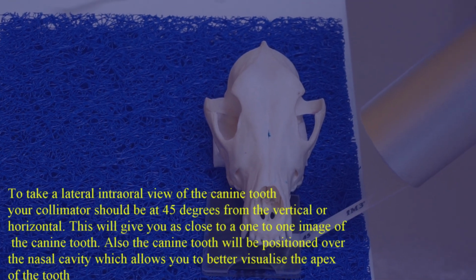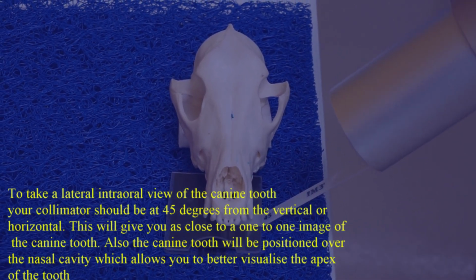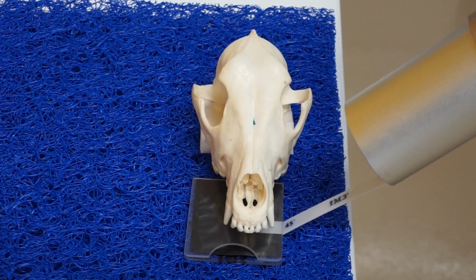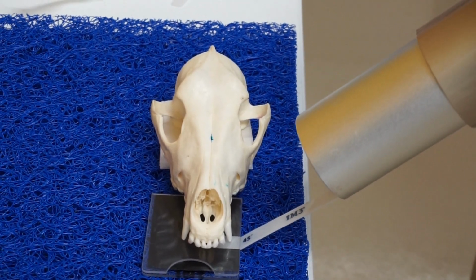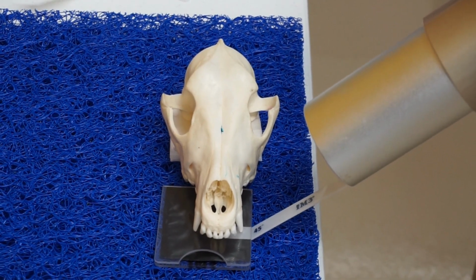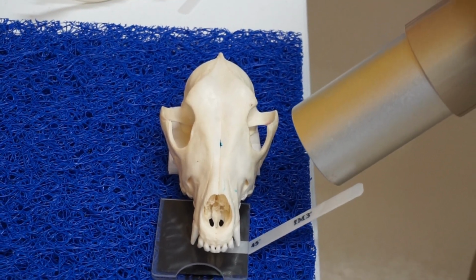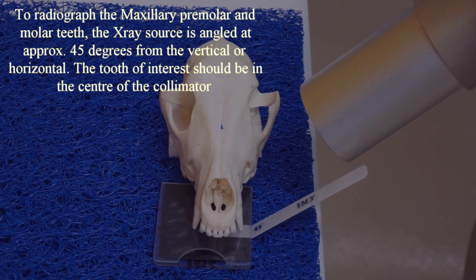And then we're going to drop to about 45 degrees. Now with this marker here, you can work out what 45 degrees is, and you can rest it on the marker, and that's at 45 degrees. So 45 degrees is a lot lower than you sometimes think it is. And then you'll take a lateral view of the canine. If you're going to do the premolar teeth, you just basically go a little bit further back at that same angle, and then you can shoot the premolar teeth.